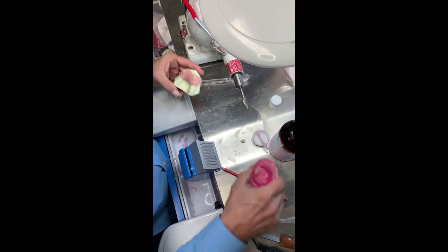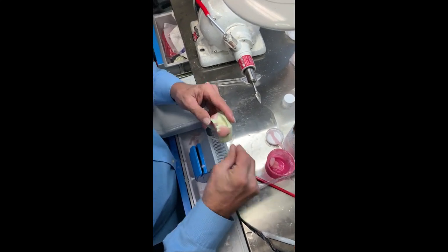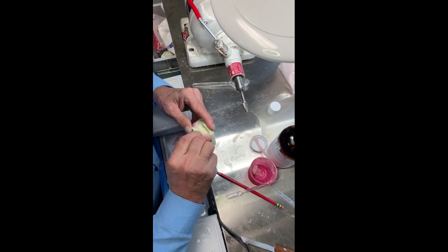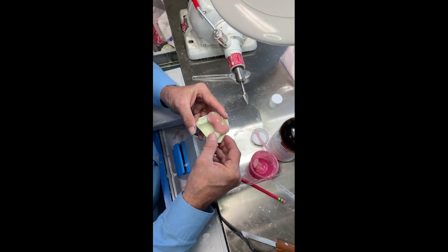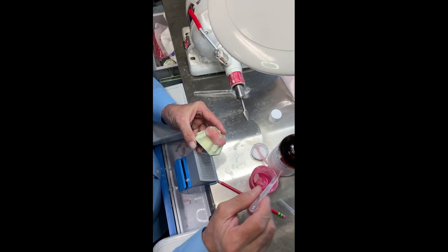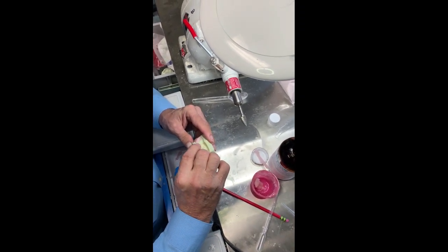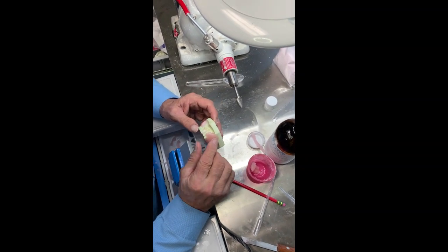And you can go ahead, put a little bit of liquid on the tooth, and place the tooth just like that. So you have time to work with this. Whether you're setting 1 or 2 or 3 teeth, you have plenty of time to work with.